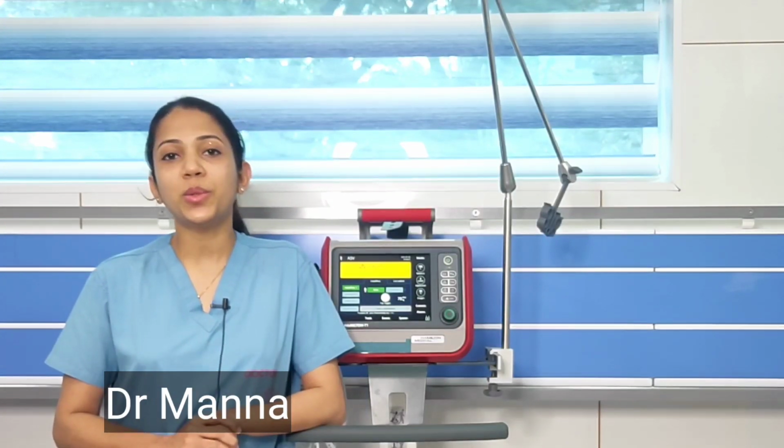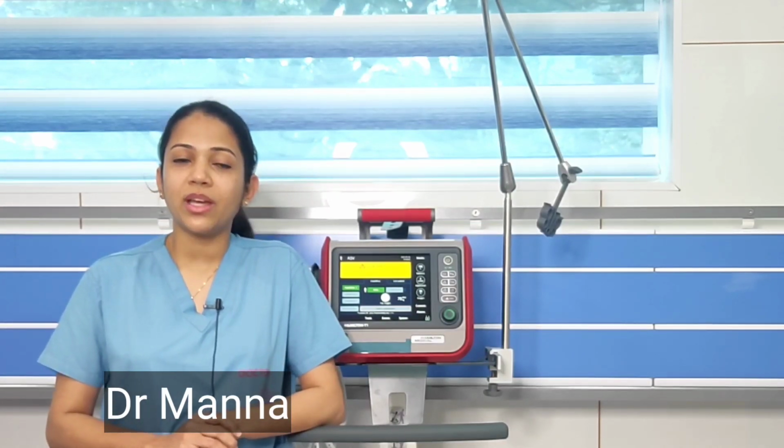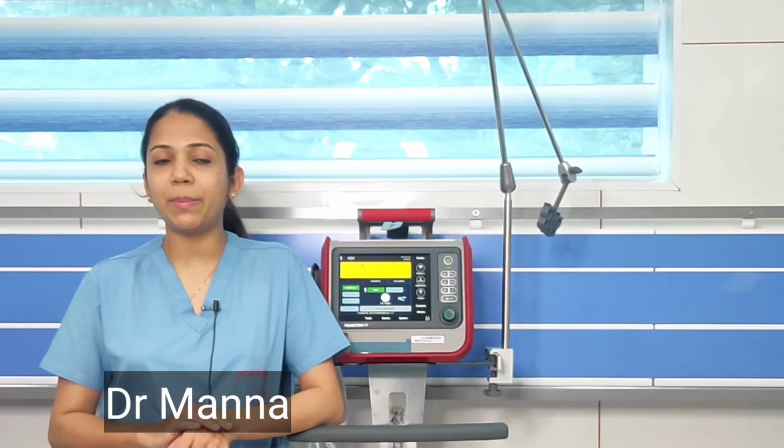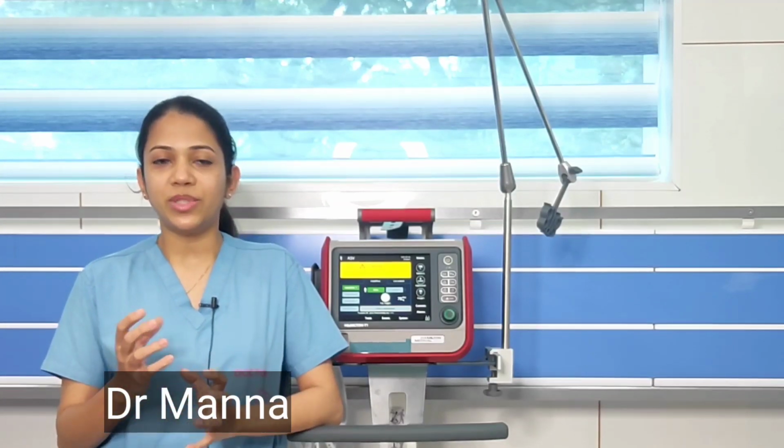Today we will be discussing trigger. So what is trigger? Trigger is a variable that determines the start of inspiration. So what do you mean by that? Whenever a patient is attempting to take a breath, that is called a trigger, that is, the patient is triggering a breath. So the ventilator will sense accordingly and will support the patient.